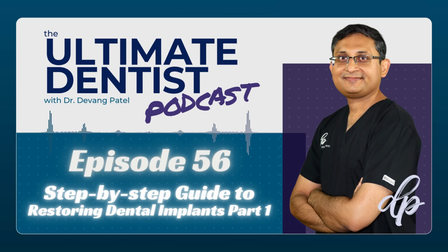Plus, when you do resin bonded bridges, you don't want to really grind either side of the teeth to create space, so you're going to leave that in high, and that will change patient's occlusion a little bit. It may be that it will settle after you take it out, but it may not settle. So that's something you need to be aware of.